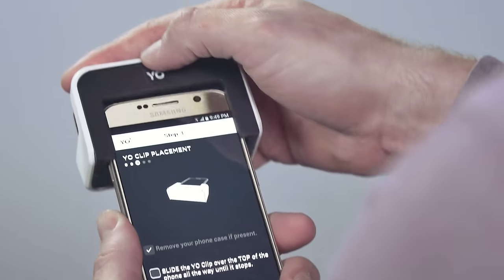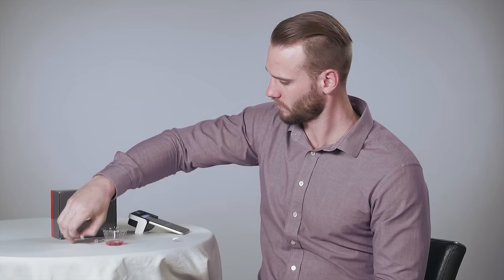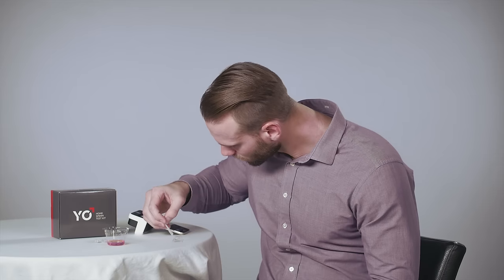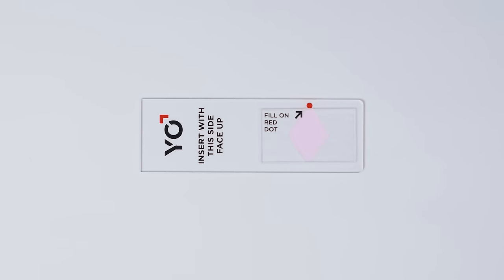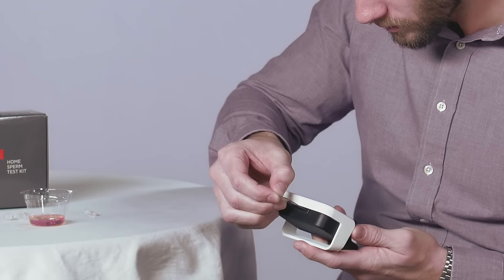Slide the Yo! clip over the top of your phone to prepare to test your sample. Next, mix your sample and withdraw some of it into the pipette. Find the red dot on the slide and place the tip of the pipette on the red dot. Slowly pinch the pipette and watch as your sample fills the slide triangle. Then insert the filled slide into the Yo! clip all the way.